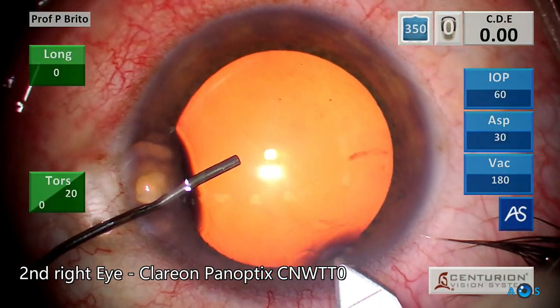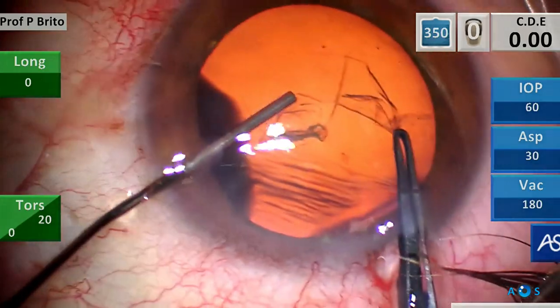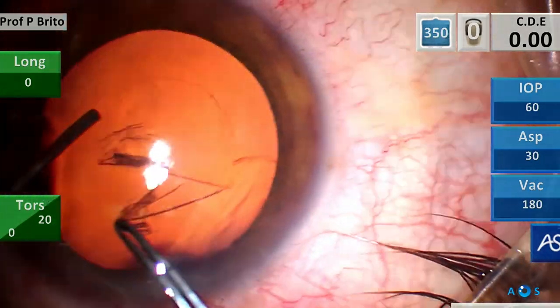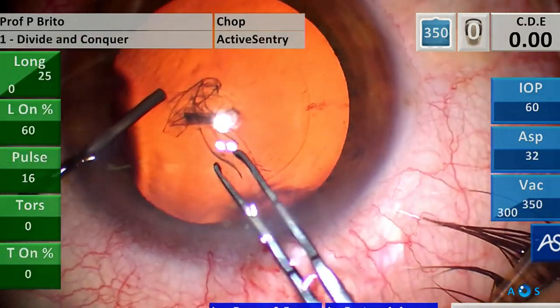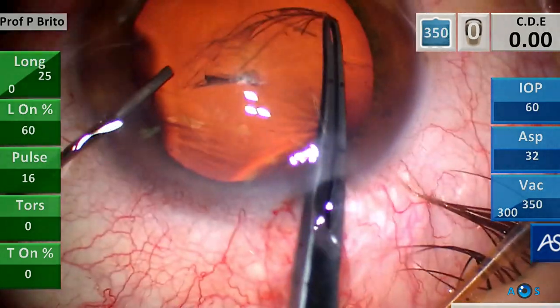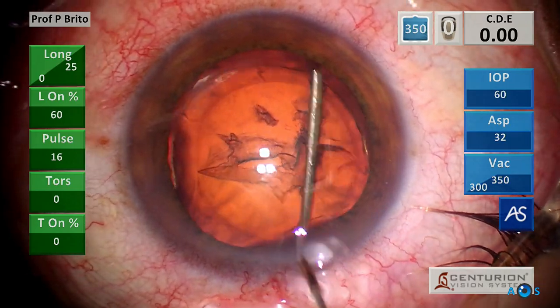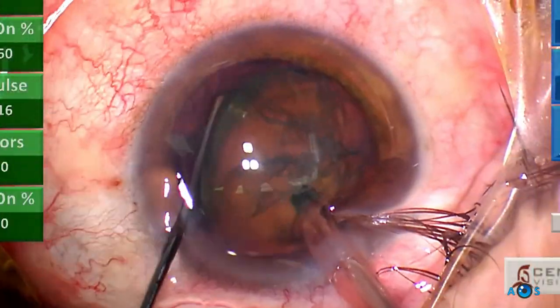Now the right eye surgery, planned for a Clareon Panoptix lens, a diffractive IOL that functions by splitting incoming light rays into three focal beams, for distance, intermediate and near vision focus. This complements well with the technology found on the Vivity lens implanted in the left eye, which functions by wavefront shaping technology that stretches the light rays to extend the focal range up to 1.75 diopters.